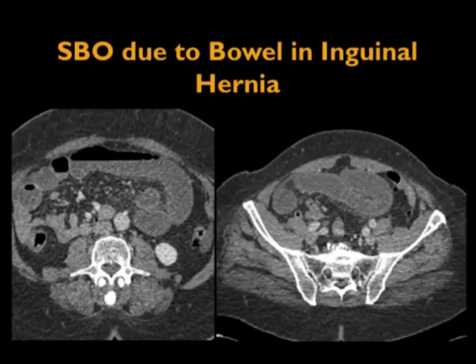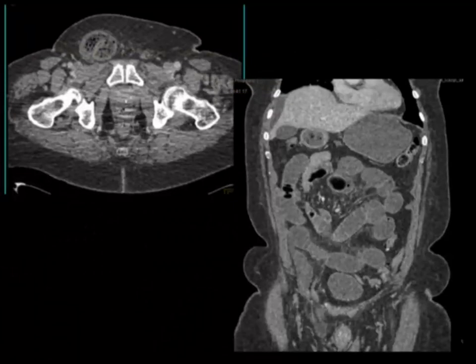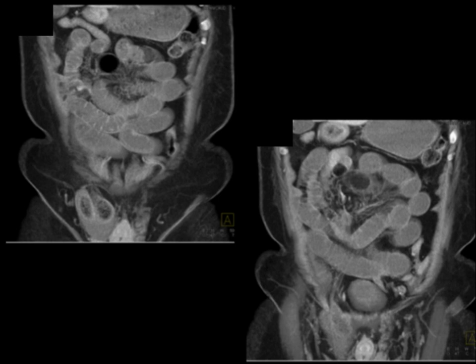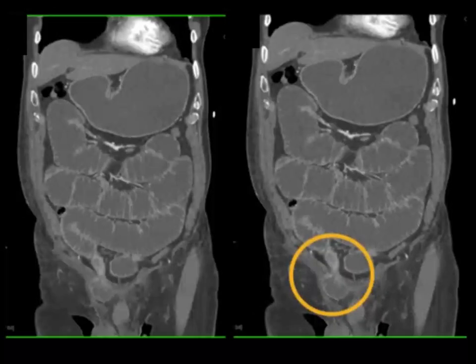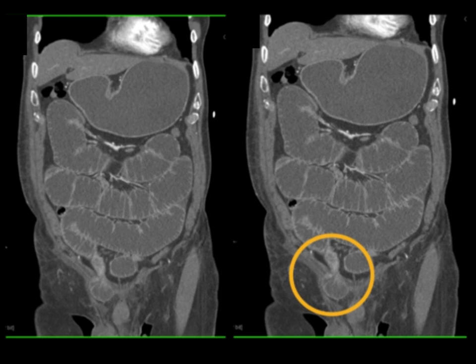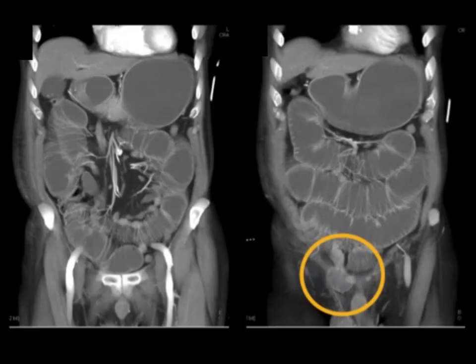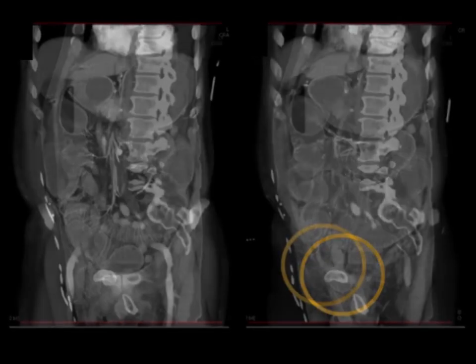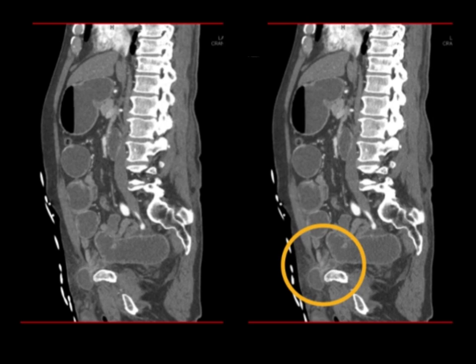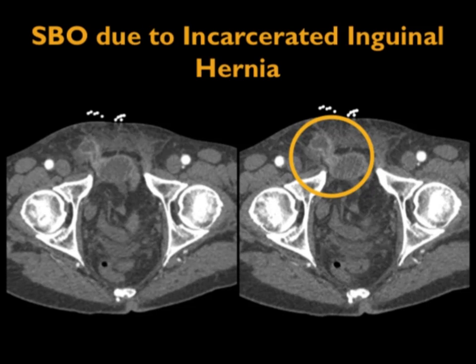In another case with abdominal distension, the dilated small bowel is followed down to the inguinal region, where an incarcerated inguinal hernia is found. Yet another case shows dilated loops of bowel with a hernia sac containing free fluid — classic for obstruction. This hernia must be reduced or the patient will develop ischemic bowel. The transition point is easily shown on the coronal view, with 3D and sagittal imaging further demonstrating the hernia. Combining all imaging views makes things a whole lot easier.